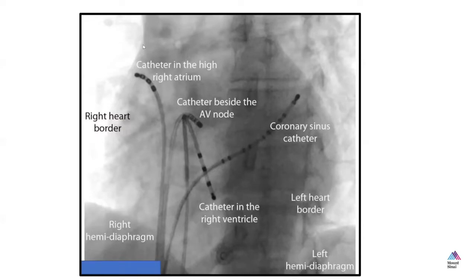You know that I typically will put mine from above, but Dr. Love will put them from below. And I think it would be fair to say that the majority of electrophysiologists actually do put them in from below, using a catheter that is deflectable because it's challenging. You have to go posteriorly and leftward in order to get in. So you need a catheter that has deflectability.